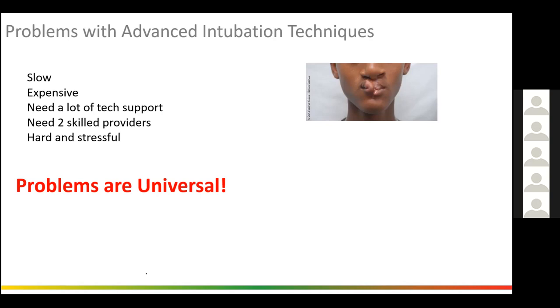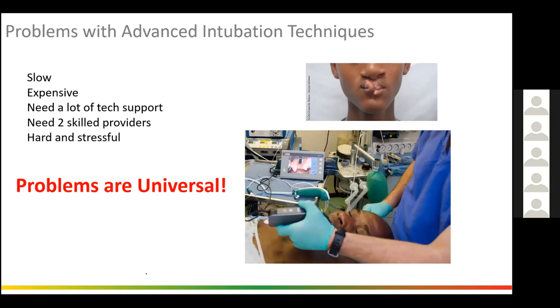And so he was getting awake fiber optics over and over, and he didn't like that. He was about 10 years old. I didn't like it. And our fiber optic scope actually broke. And so we had to figure out a way to intubate him without a working fiber optic bronchoscope. I used a video laryngoscope.